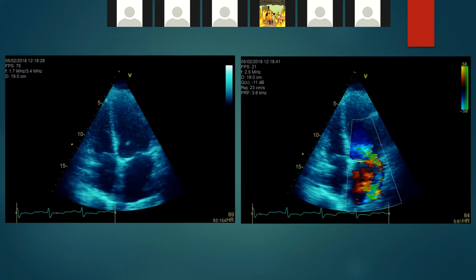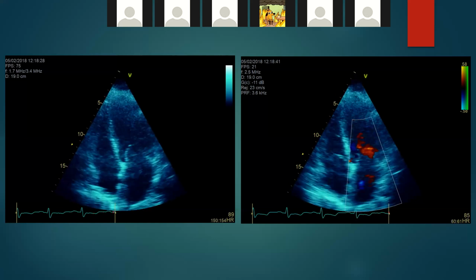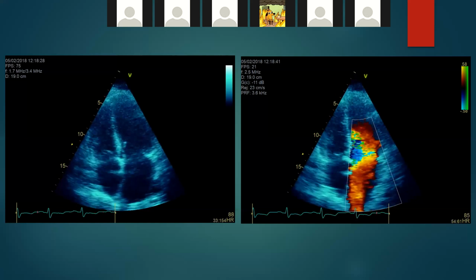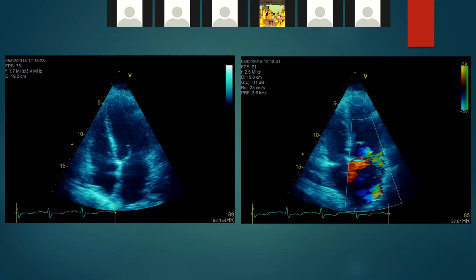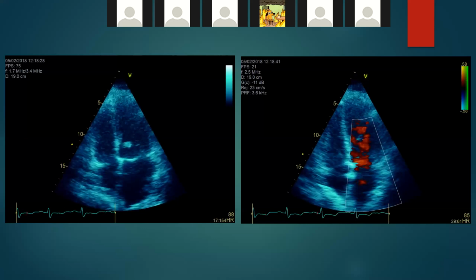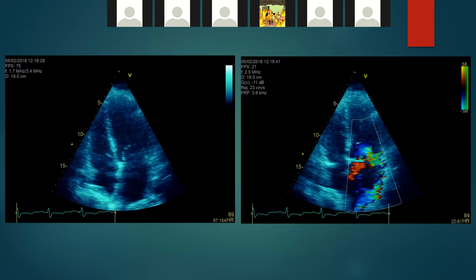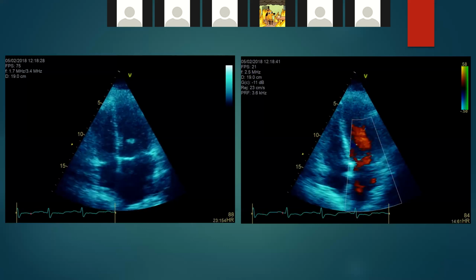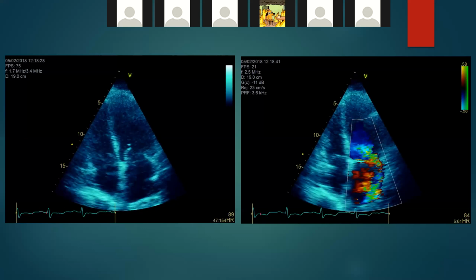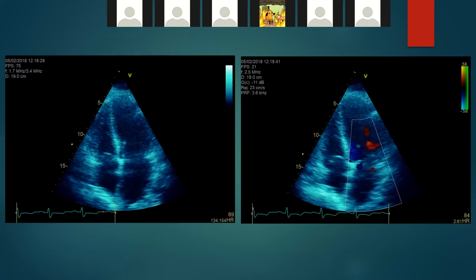Well, I guess it's just a wall-hugging jet. The easiest and first thing that most of us do, even those who have experience, is assess regurgitant jet severity on the basis of color flow Doppler. It's almost always the least sensitive. So we're all very cautious about using color flow Doppler to assess severity of regurgitant lesions, especially given the issues with loading conditions and technical settings. I don't know what this lady's blood pressure is. I don't know what her filling status is. She's definitely not at rest.